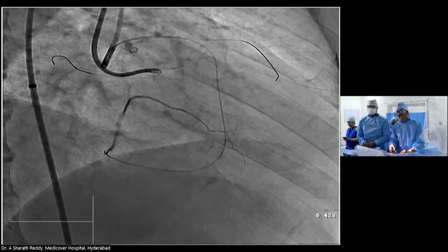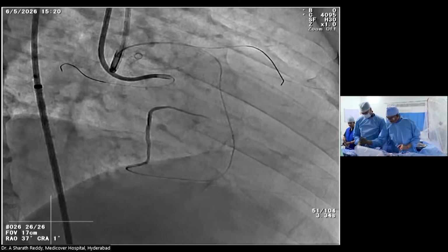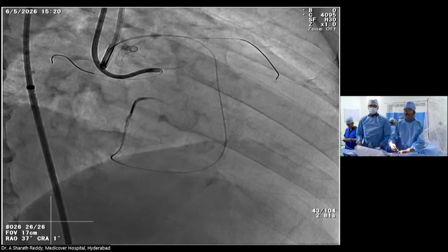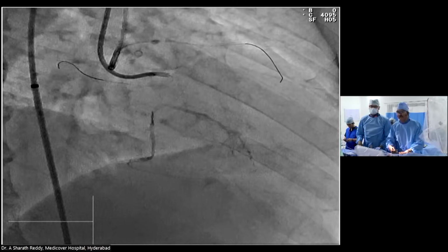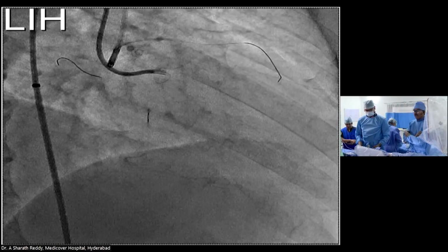So you can see it's again an ambiguous distal cap. It's not trivial because here you can get out as well, and I think you need to puncture. And from retrograde, I would always prefer a Gaia 3, because you lose the power of the wire because of the long course of the microcatheter through the heart. So a Gaia 3 is, I think, more powerful.